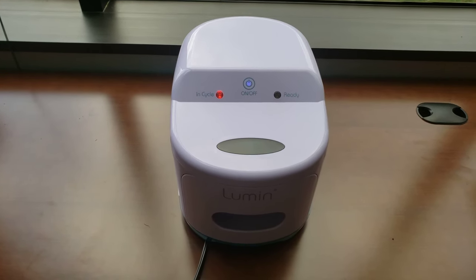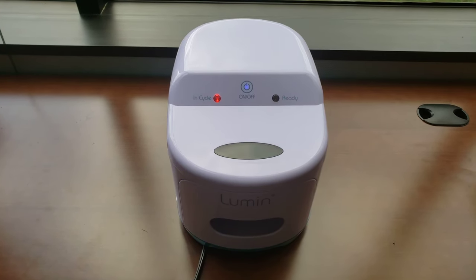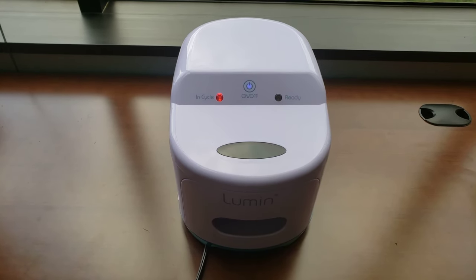It'll take five minutes. When it's done, the red light will turn off and your green light will turn back on, and then you're ready to go.